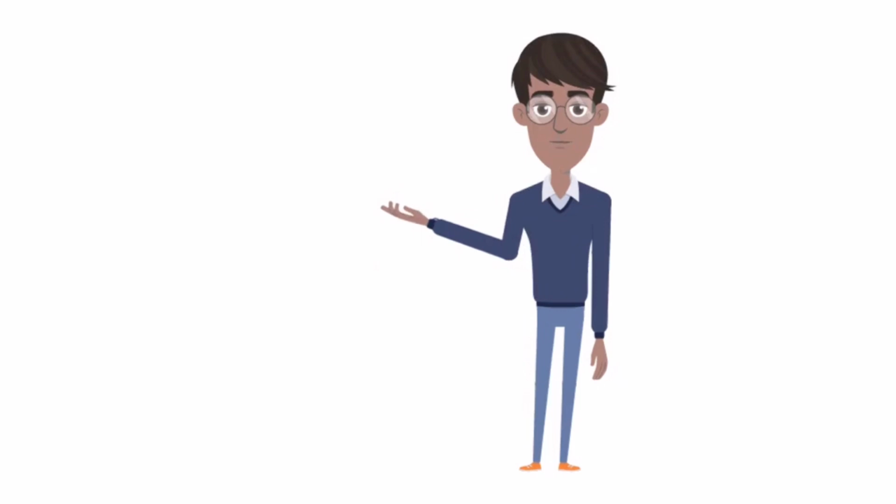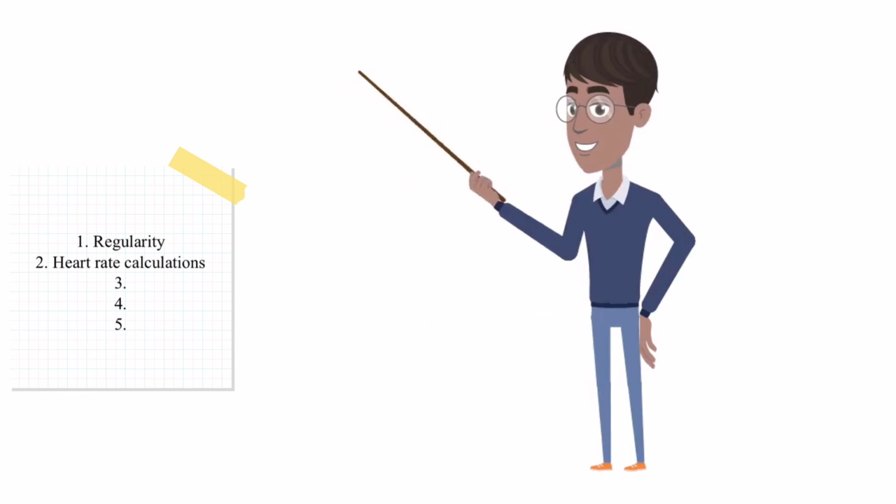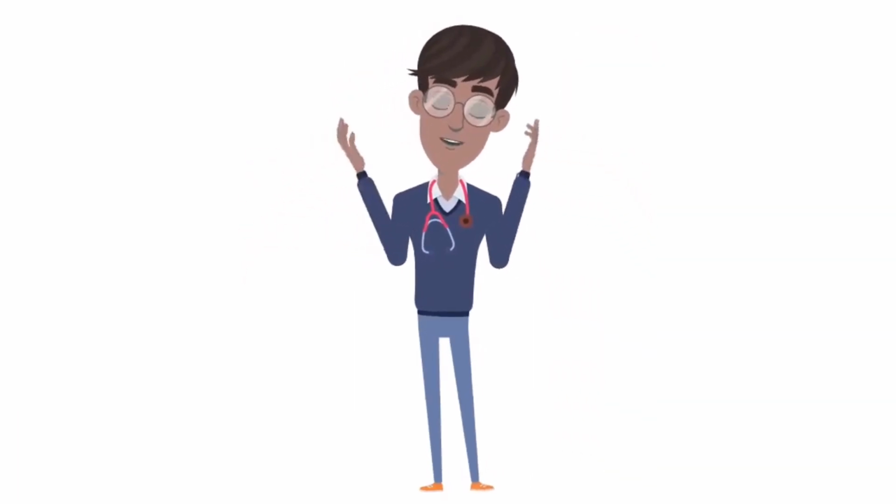Following the systematic pattern of reading an ECG, we have gone through regularity and heart rate. We are going to stop here and continue from another video.